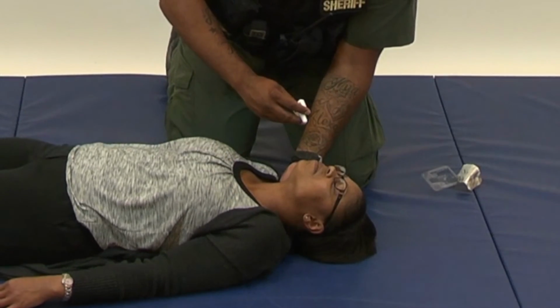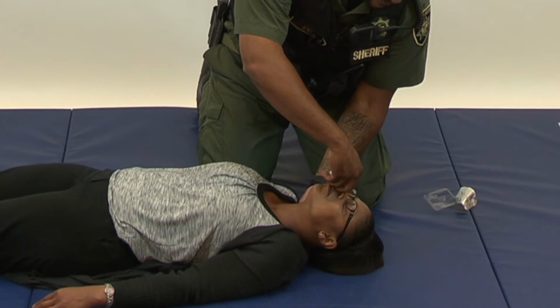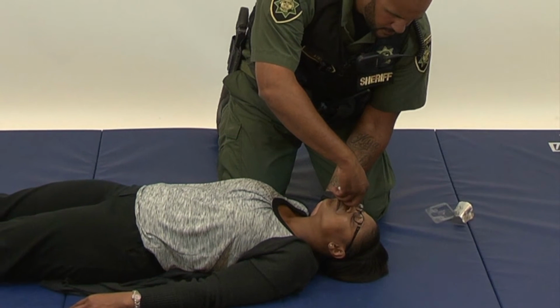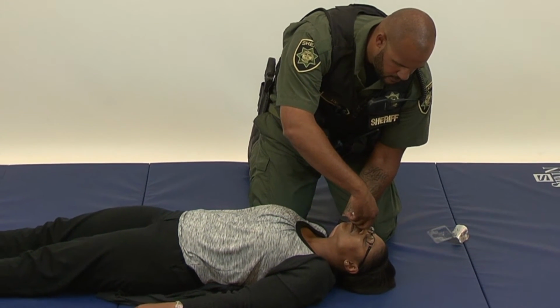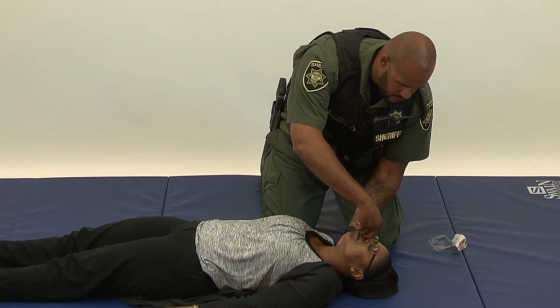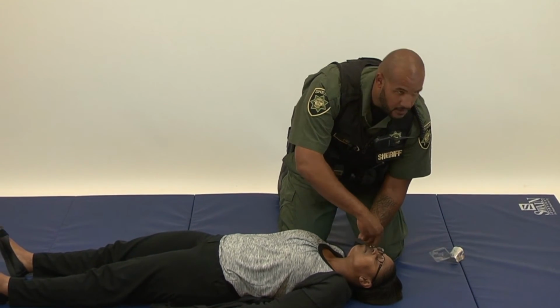Tilt the person's head back and support their neck with your hand. Gently insert the tip of the nozzle into either nostril until your fingers are against the bottom of the person's nose. Press the plunger firmly to spray the entire dose of naloxone into one nostril. Remove the naloxone from their nostril after giving the dose.